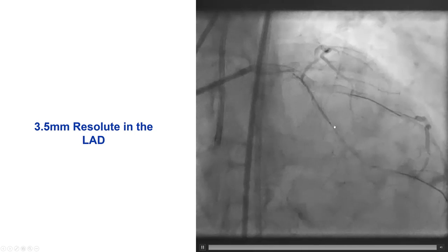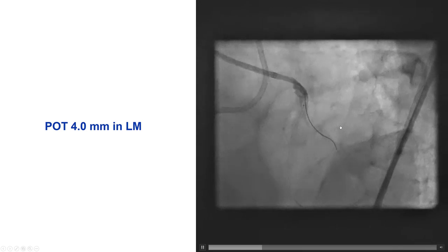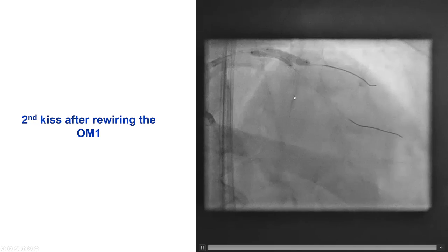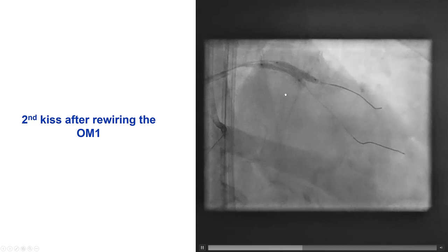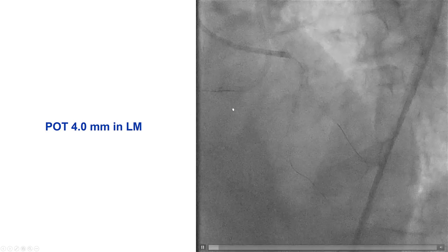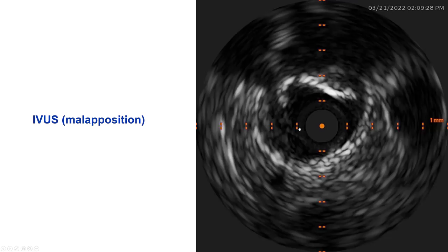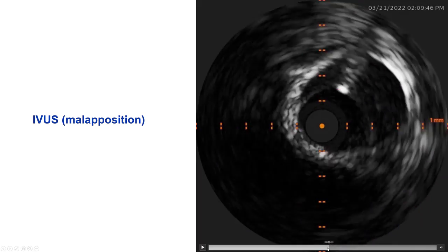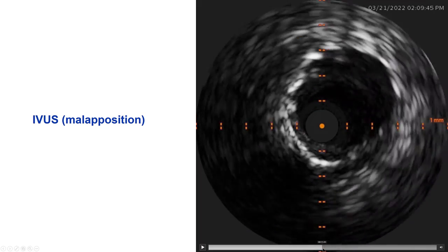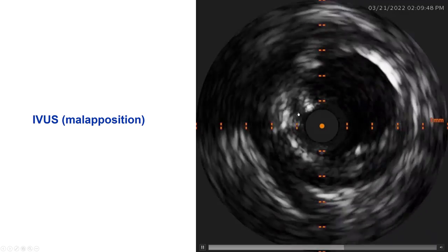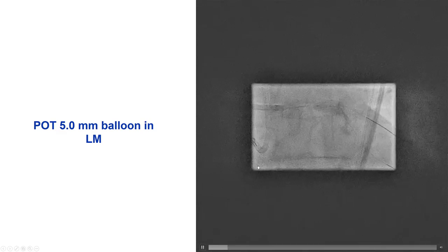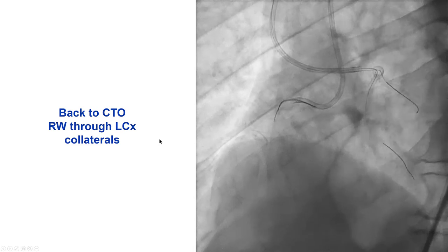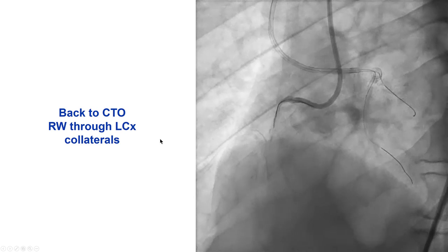We then placed the stent from the left main into the LAD, did the proximal optimization with a 4.0 millimeter balloon, rewired into the circumflex, and did the second kissing balloon inflation and a repeat POT. Intravascular ultrasound showed good expansion but there was some stent malapposition more proximally towards the proximal end of the left main. That is why we decided to do POT with a 5.0 millimeter balloon, which gave a nice result.